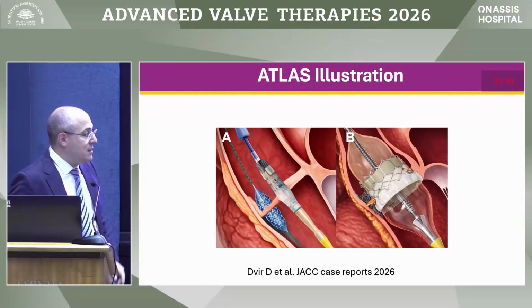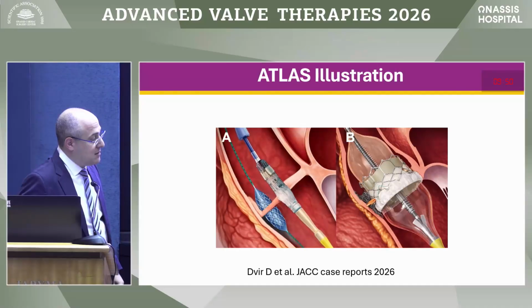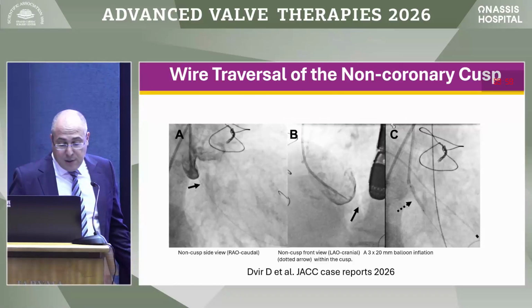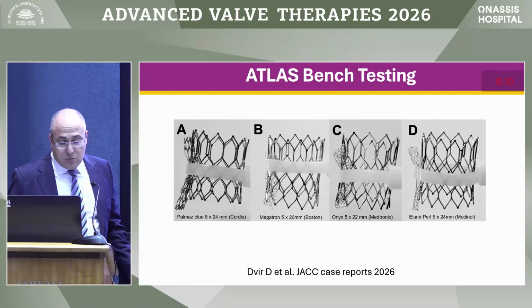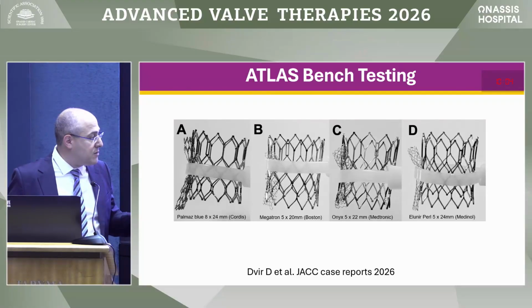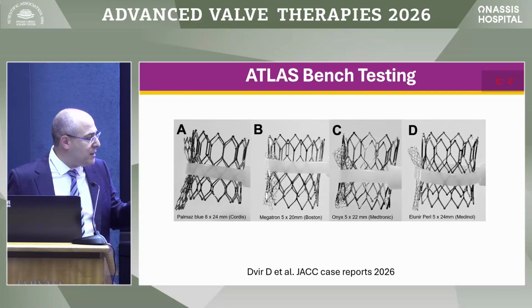Maybe, Danny, you also have a crushed stent, so this is possibly a prothrombogenic condition, right? Could be. Yeah. So basically, before we did this case, we did some bench testing, we tried to understand what would be the best stent to use. At the beginning, we thought maybe we'll put a PVL closure device, but it didn't make sense. You don't need a nitinol device. You need something not slippery.